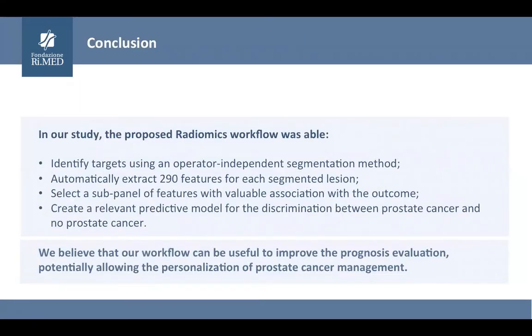In conclusion, in our study, the proposed radiomics workflow was able to identify targets using an operator-independent segmentation method, automatically extract 290 features for each segmented lesion, select a subpanel of features with valuable association with the outcome, and create a relevant prediction model for discrimination between prostate cancer and non-prostate cancer. We believe that our workflow can be useful to improve the prognosis evaluation, potentially allowing the personalizing of prostate cancer management.